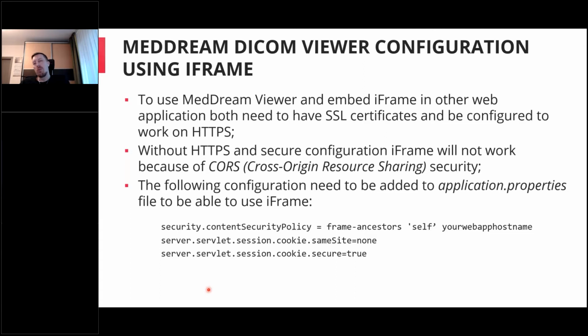As time goes on and browsers keep getting more and more secure, there are a lot of security policies, cross-origin resource sharing policies, and all these things. So basically, you would eventually need to have an SSL certificate for MedDream and an SSL certificate for your web application in which you would like to share MedDream, because otherwise the browser security will not allow you to embed MedDream into your web application.